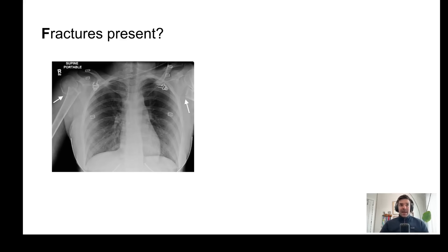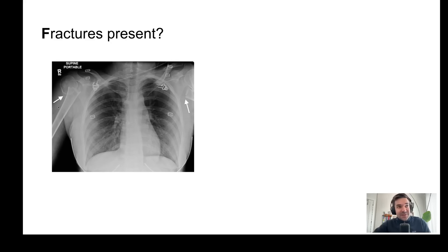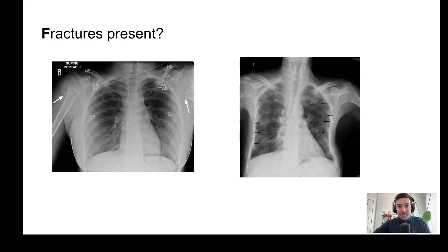Are there any obvious fractures? I find if I don't specifically look for them I might miss them. Here with the arrow sign you see a large humeral fracture, and this patient here has multiple rib fractures.